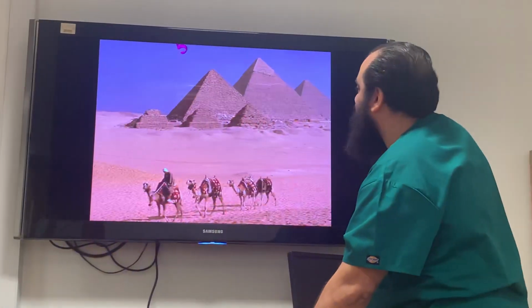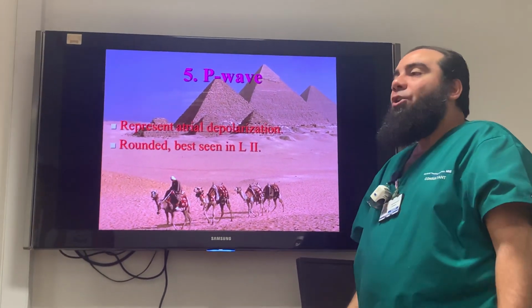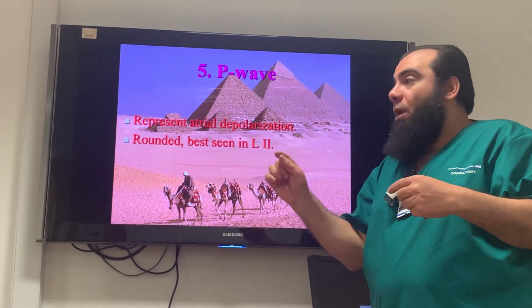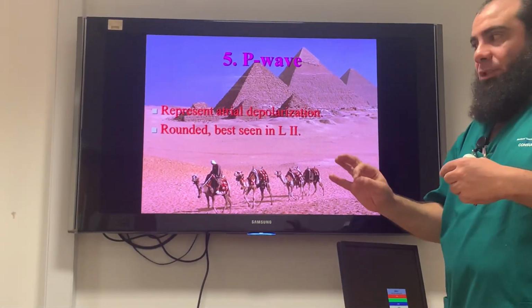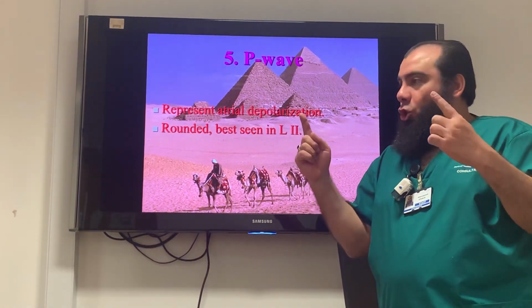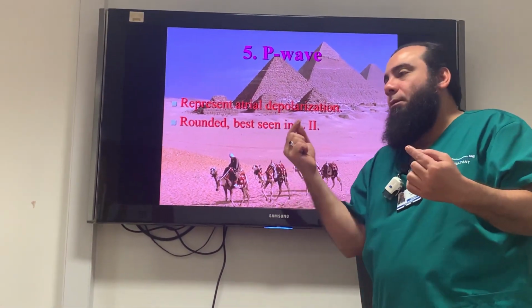What do you know about the P wave? It represents, as we agreed in the first lecture, the atrial depolarization. It is not the atrial contraction. How many atria do we have? Two. How can they come together in a single P wave?